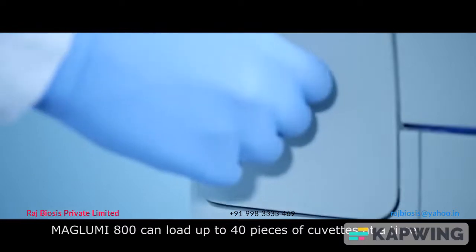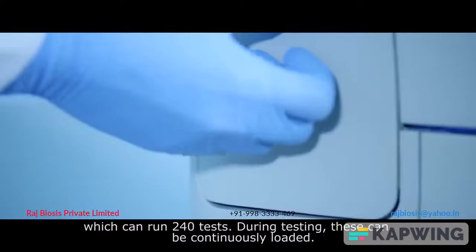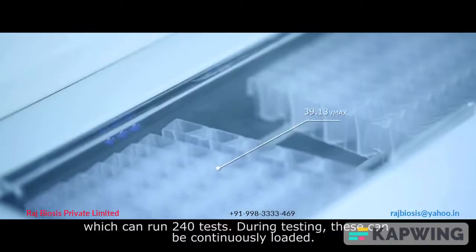The Maglumi 800 can load up to 40 cuvettes at a time, which can run 240 tests. During testing, cuvettes can be continuously loaded.